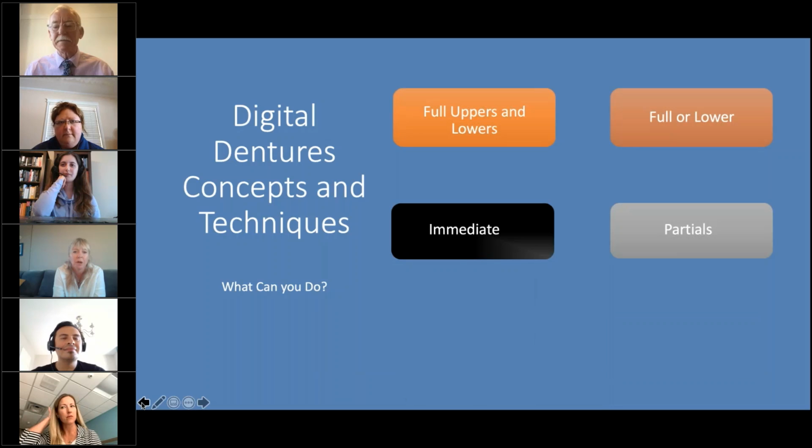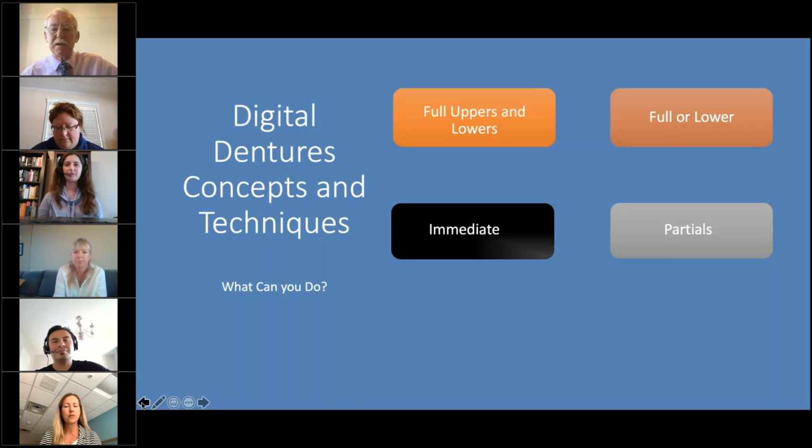We use PEEK as well for the meshes and the implant dentures for a lot of our surgeons, don't we? Just because it's lighter and it's pink as well. Thanks for that, Deborah. Whereas PEEK is used in the crown and bridge area, where you can actually build ceramics up on PEEK, and it is very, very.